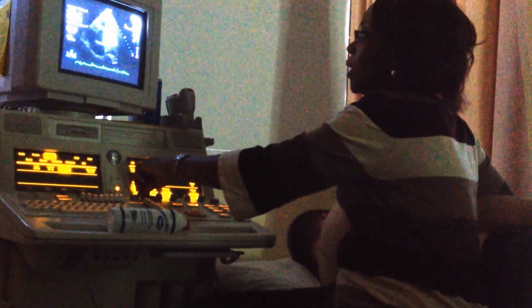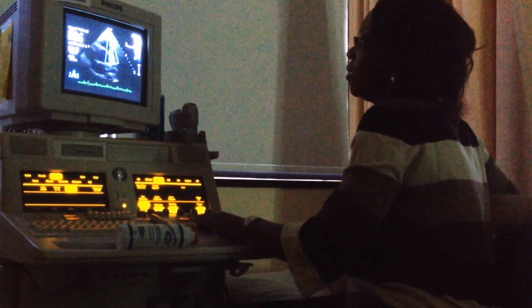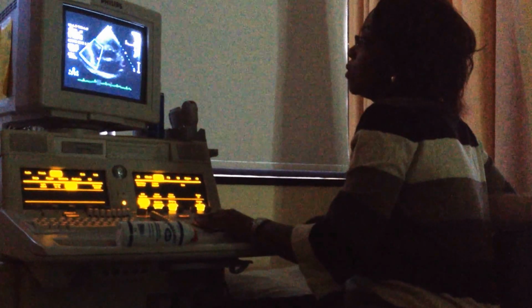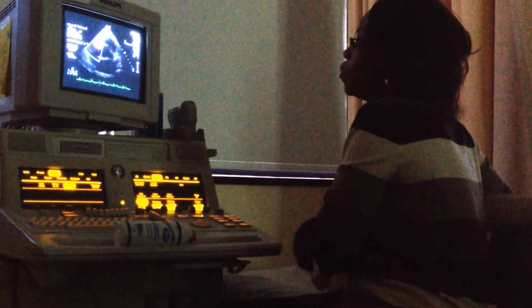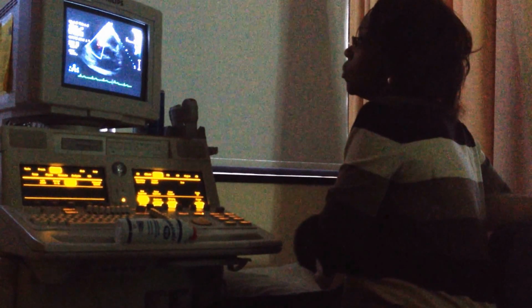I'm going to increase my gain all the way up and back it down till it no longer speckles. That lady called it popcorn artifacts. What lady? On the video. And then I bring over and look at my aortic, and then I'm going to sweep over and try to see if I can see my tricuspid. And that's the breathing technique. Sometimes you have to have them take a half a breath in. Sometimes you can clean it up that way also. Breathe normal.